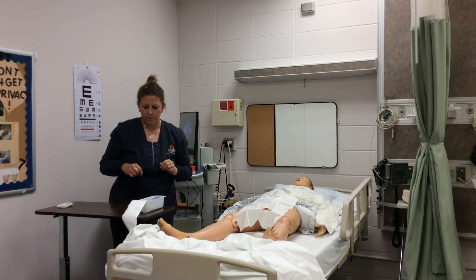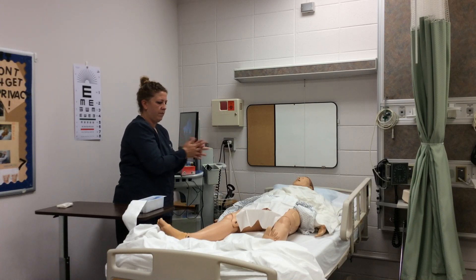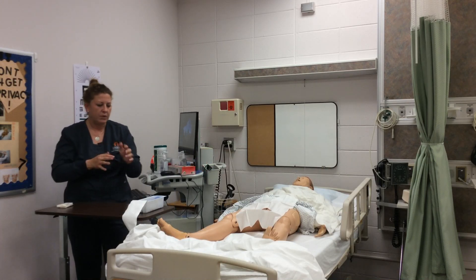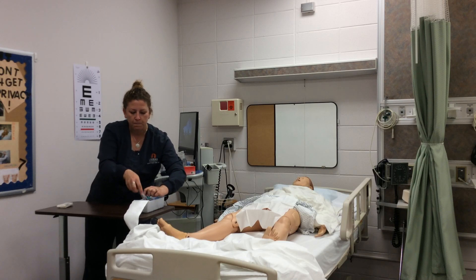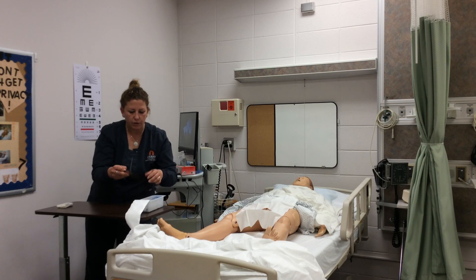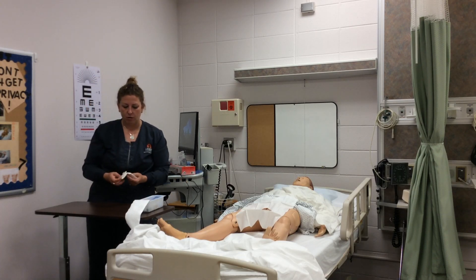She performs hand hygiene and puts on sterile gloves. She swaps out the incorrect swabs, noting: 'If you have the wrong swabs in your kit, your instructor will do this for you during your check off.' She confirms: 'I just performed hand hygiene and now I'm going to put on my sterile gloves.'